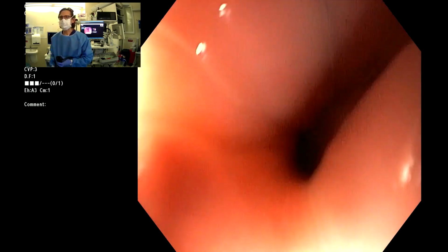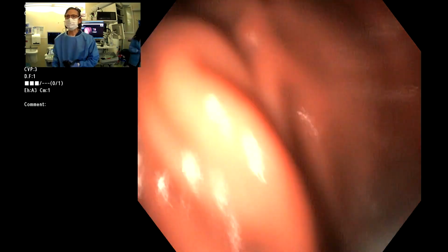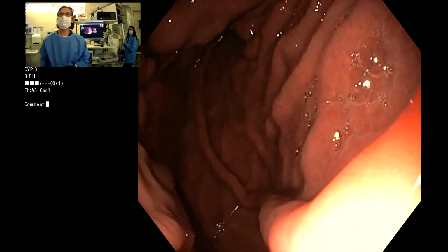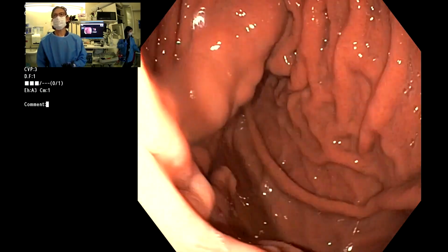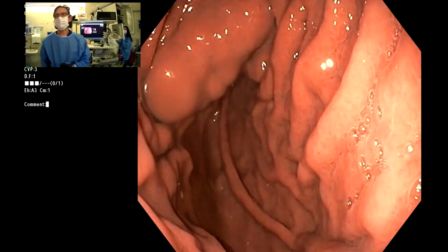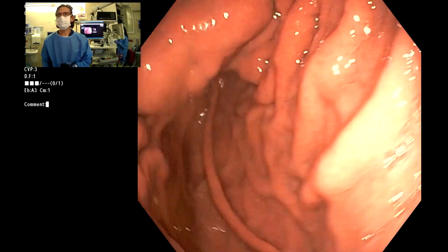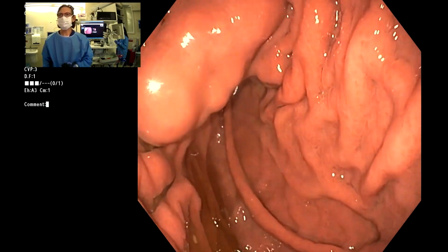Today we're going to perform EUS-guided coil plus glue of this very large fundic varix. It looks like it's somewhere in the order of 3 to 4 centimeters endoscopically, but we'll see on EUS. This could be a conglomerate of varices. We'll look for the so-called feeder vessel.